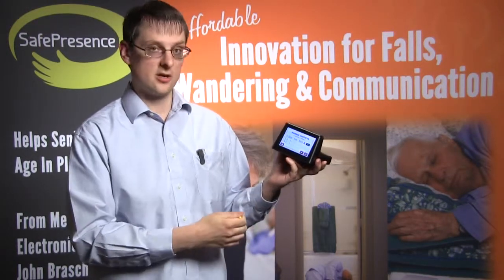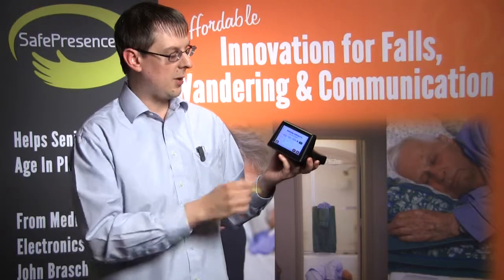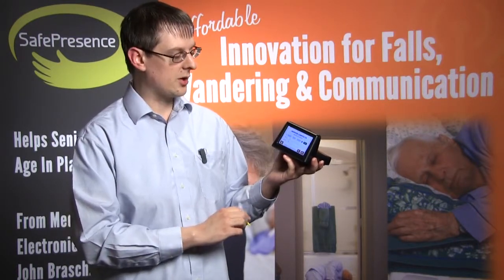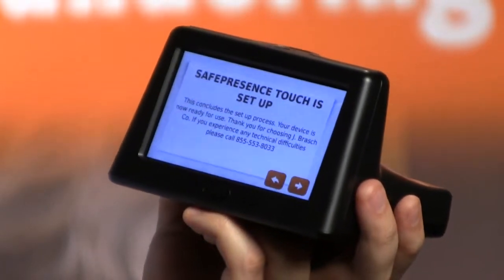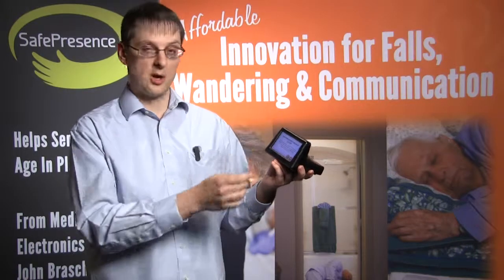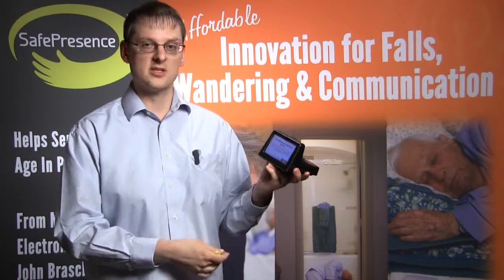We have one contact in here now, and as you can see, we can delete that contact or send a test message to it. We can also add 2 more contacts by hitting the little person plus here in the corner. For right now, let's just go ahead with the one contact. I'll hit OK. The next screen you see is the final screen. The SPTouch is setup screen. If you have any problems, there's a number right here on the screen for you. You can call us. Other than that, though, your device is set up and ready to go.